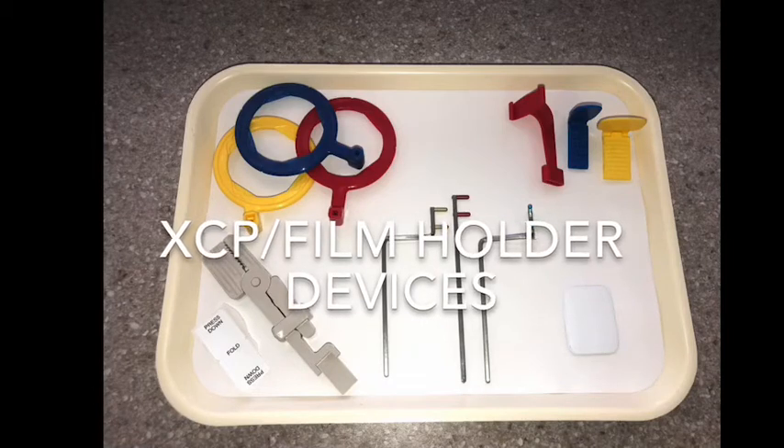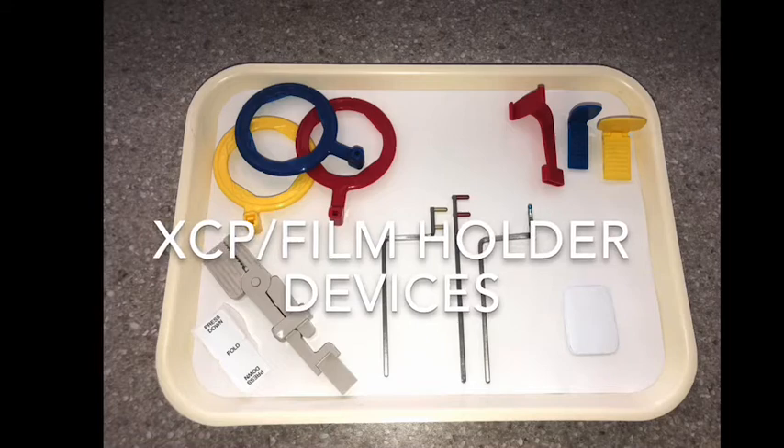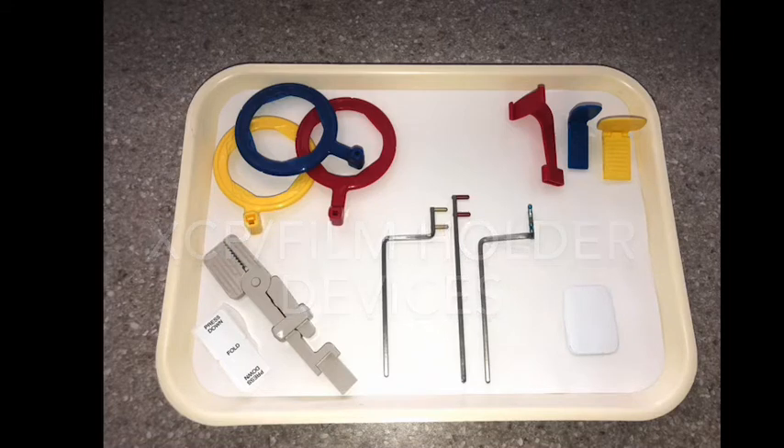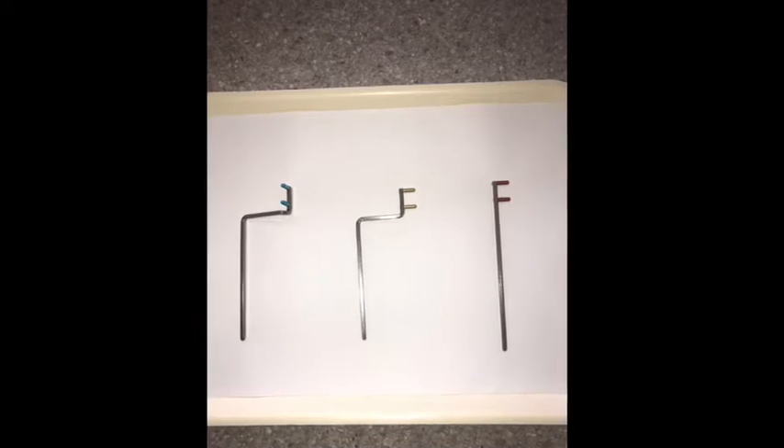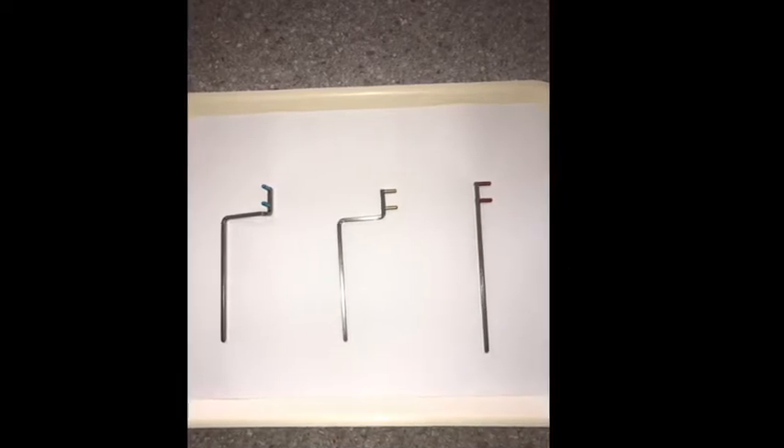We're going to show you how to use the XCP film holder devices used for manual x-rays. There are three different bars: one for anterior, one for posterior, and one for bite wings.